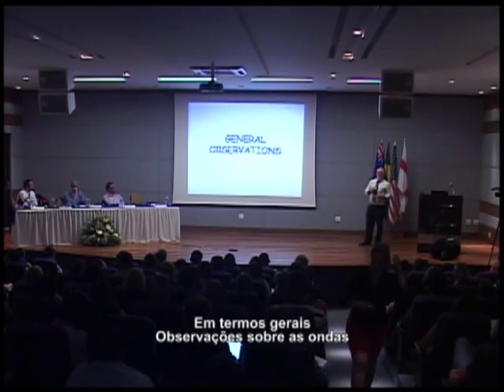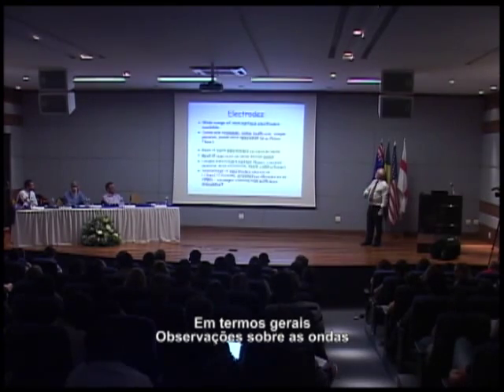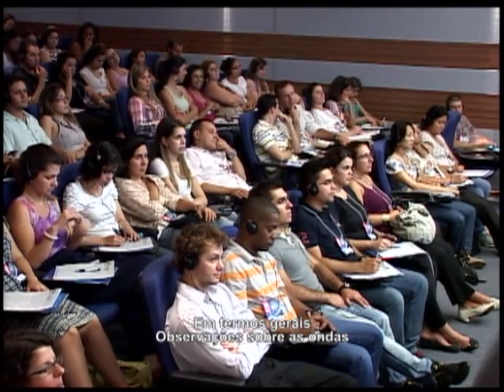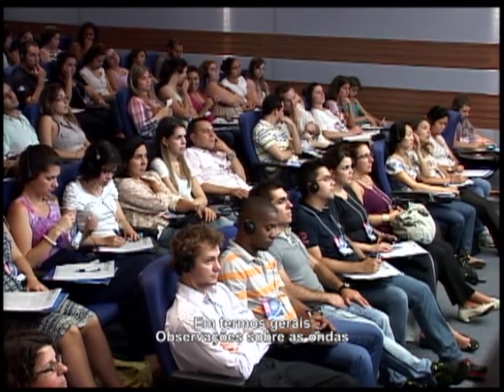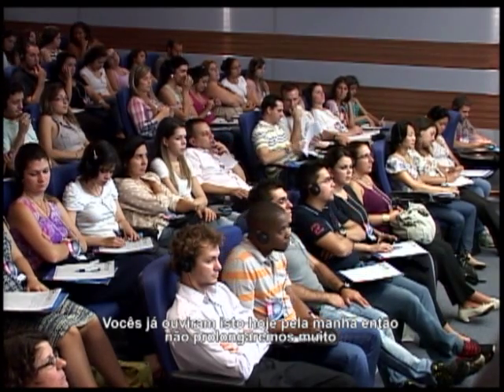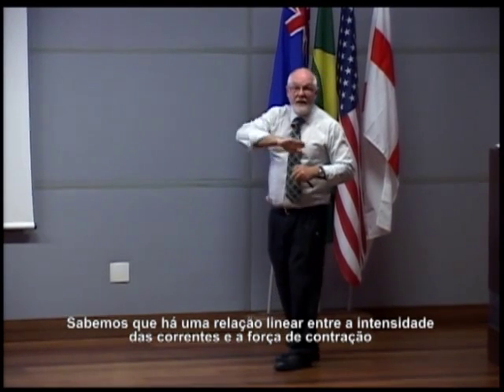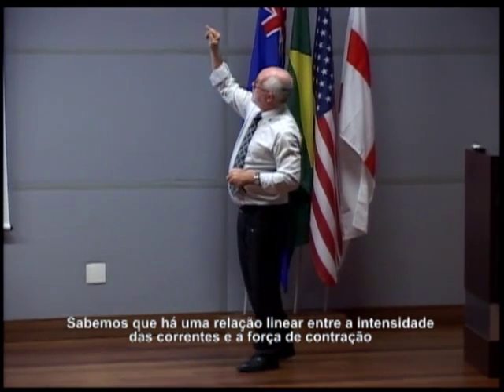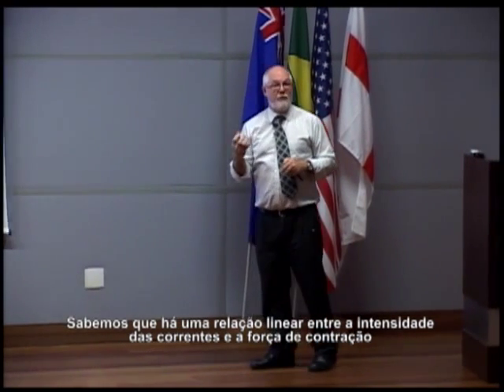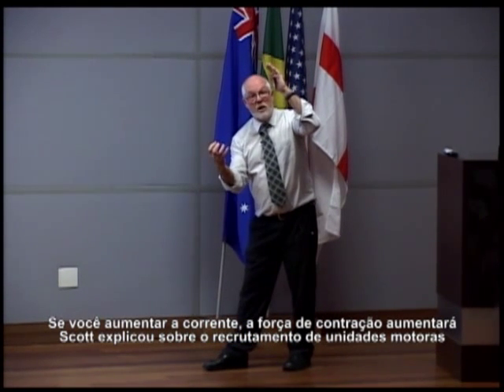Okay, so in terms of the general observations, let's go to the keyboard, Tim. Right, waveforms, observations. You've heard this already this morning, so we won't be too long. We know there's a linear relationship between current intensity and your contraction force. If you turn the current up, the contraction force will go up.